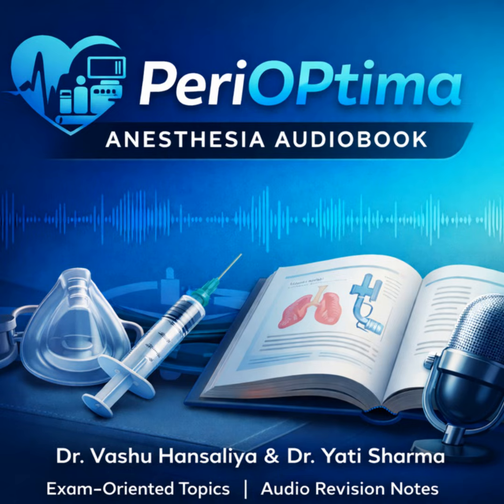Absolutely. The hyperangulated blades, like the classic Glidescope with its 60-degree curve or the CMAC D blade, are designed almost exclusively for indirect vision. And their shape is their superpower. It is. Their extreme curve allows them to provide a superb view of a very anterior larynx, that classic grade 3 view that a standard DL just can't get. But because of that shape, they require a very specific technique.